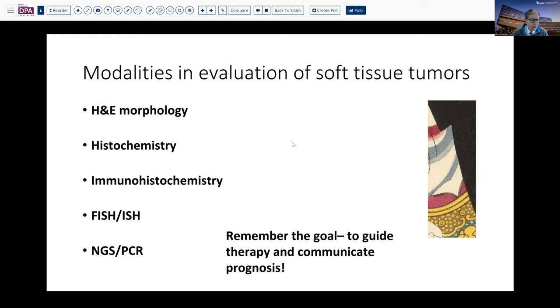This illustrates some of the ways that we approach soft tissue tumors. We have to first look very carefully at the H&E morphology. That has to be our guide and to govern the subsequent workup and evaluation. We can then apply histochemical means as well as immunohistochemistry, but very often in soft tissue tumors these are not particularly revealing in terms of a specific diagnosis.